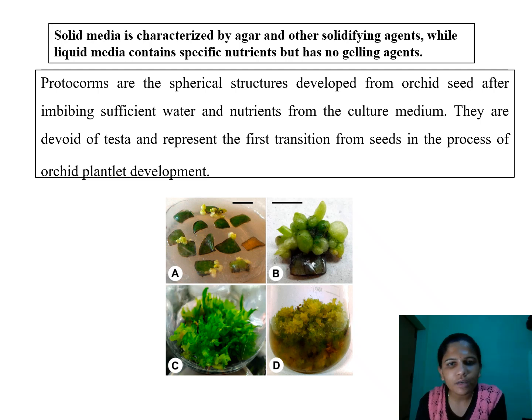So this lecture may be helpful for you to know which types of media are available, and which media will be suitable for different kinds of work. Normally, solid media we can use for almost all plantlets. Suppose we are concentrating on protoplast culture or callus culture, we can use liquid medium as well. So liquid medium also helps in those kinds of things, and for those protocols it is very useful.